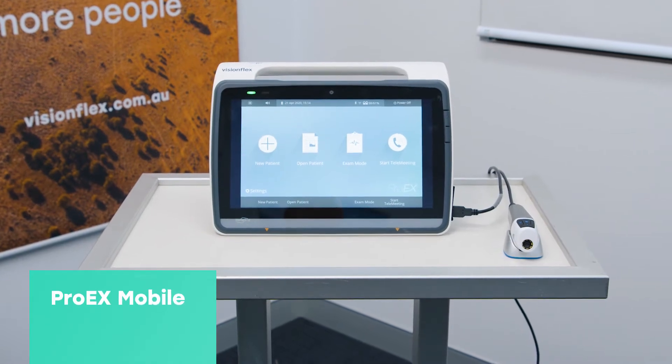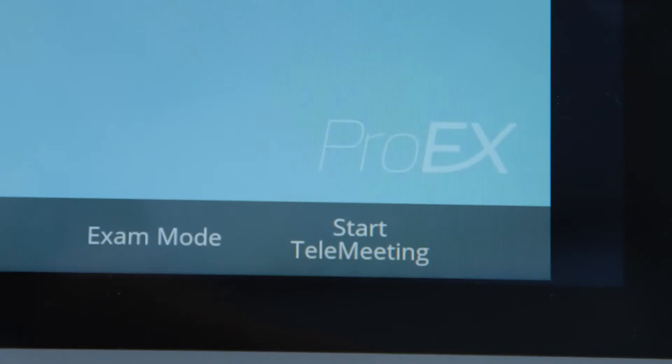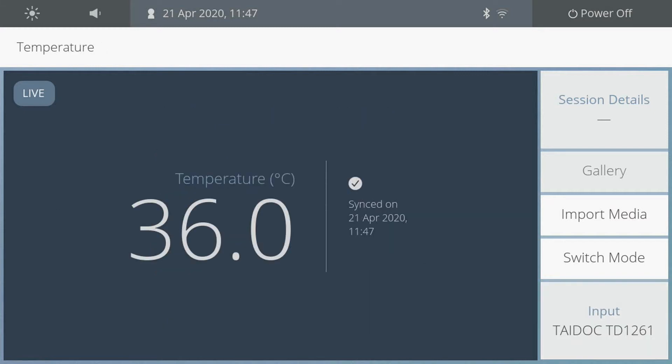The Pro EX Mobile is a user-friendly and revolutionary all-in-one device which allows doctors and health professionals to carry out a wide range of patient examinations and to connect to colleagues and specialist services remotely.